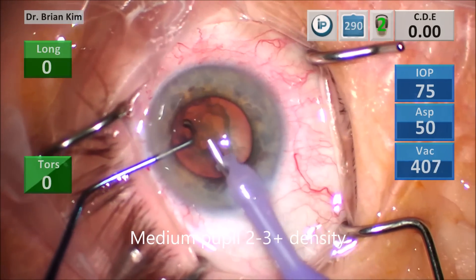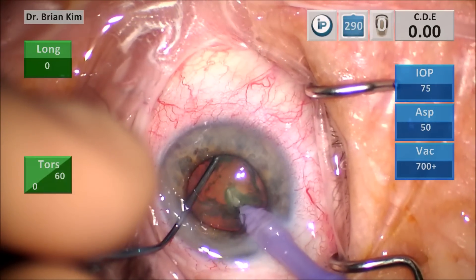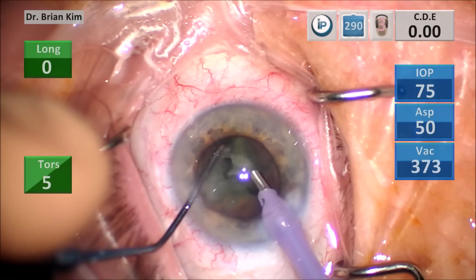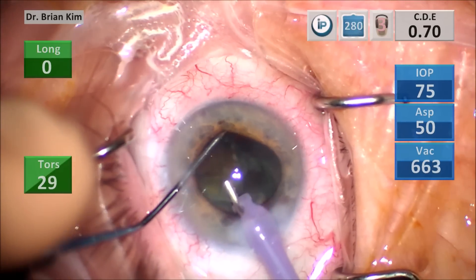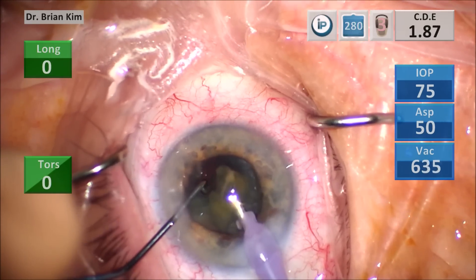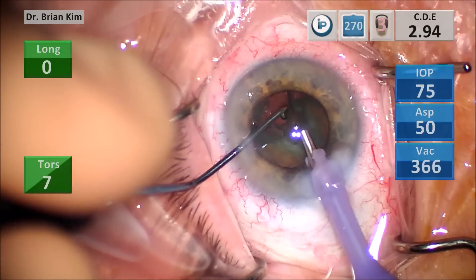This is a medium pupil but a slightly denser lens, 2-3 plus, just to show that I'm able to do the same exact technique on a wide variety of densities and pupil sizes. Again, the chopper is initiating all of the action. The FacoTip is in the same position the entire time — that was all under foot position zero. Now I'm emulsifying the pieces. You can tell this is a denser lens; the CDE is going up pretty quickly. I'm using the chopper again to go out underneath the anterior capsule, just to slide that quadrant towards me, and then emulsify.